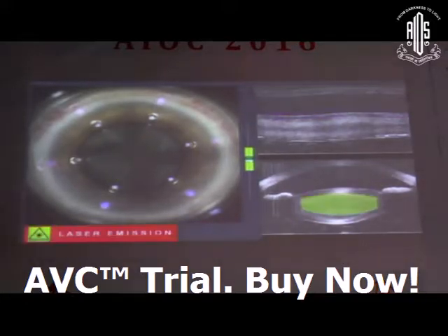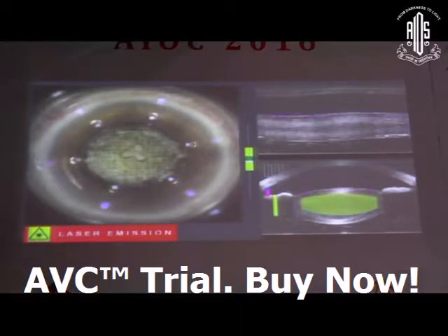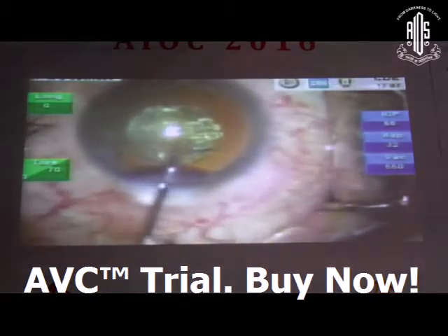This is the capsulotomy that is happening. There you see the capsulotomy. Now watch the matrix pattern. Now when you're looking at the matrix pattern, you can see that there are cuts that are coming in. Can you see this? This is a matrix pattern. That is the horizontal cut. Did you see that horizontal cut coming? And then you see the second horizontal cut. So do you understand? You had the whole thing going down and you have the horizontal cuts that are coming in. So you actually have very small little pieces which you can go ahead and aspirate.